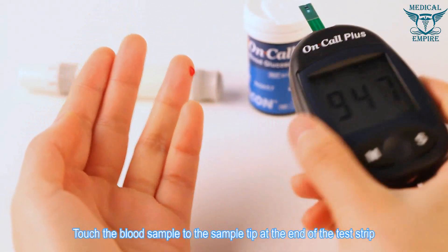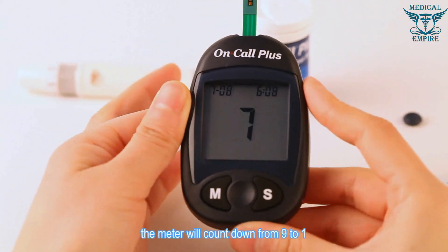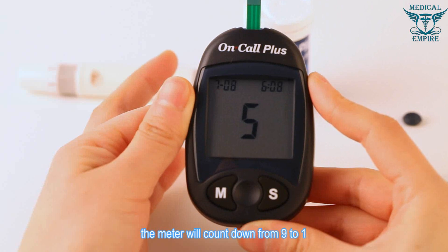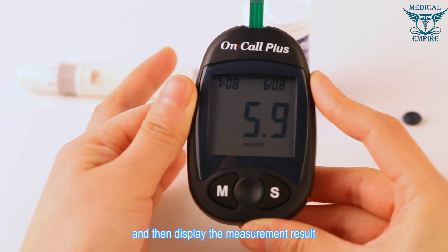Touch the blood sample to the sample tip at the end of the test strip. Once a sufficient sample has been applied, the meter will count down from nine to one and then display the measurement result.